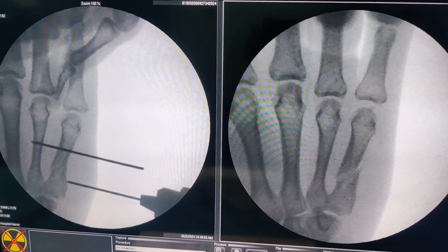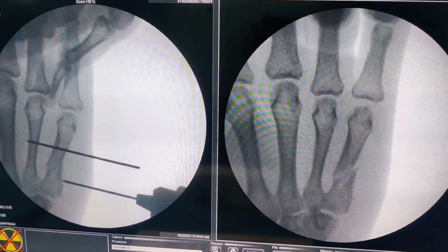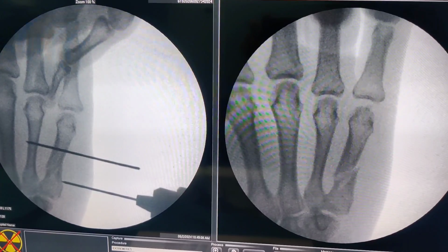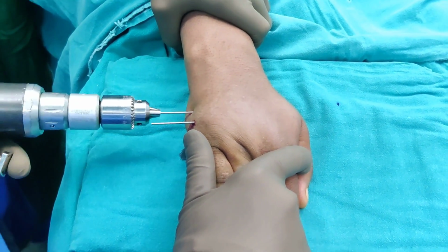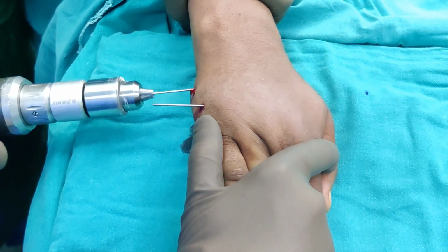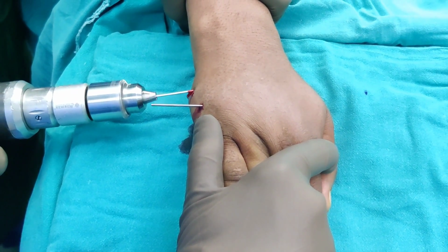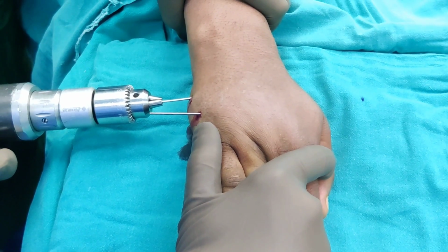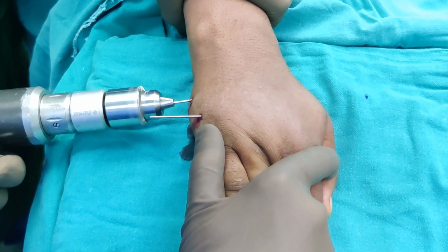So again, I am going to pass my wire in the same principle, angling it slightly dorsal. I'm just passing it, and then I think I've skidded off. Let me reposition and then I'll join you back. So again, you can see I am angling it slightly upwards or dorsal, and then again I have felt it coming out, and then again I am feeling the bone.